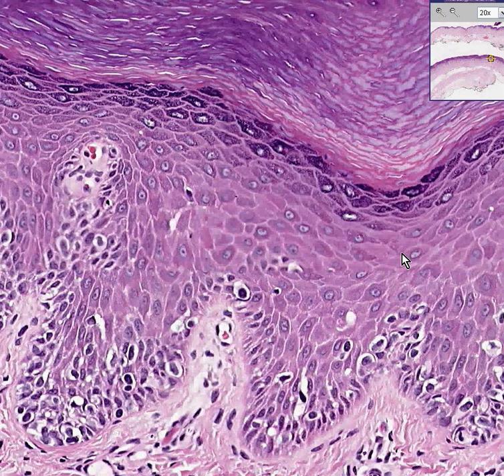that early malignant melanoma is present or very soon to be present. And this case is called melanoma in situ. Notice these cells have not infiltrated yet into the dermis, papillary or reticular dermis, but it is felt that when you see changes like this, it's just a matter of time.